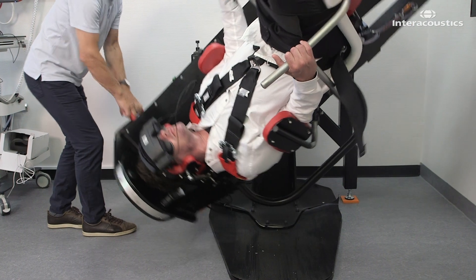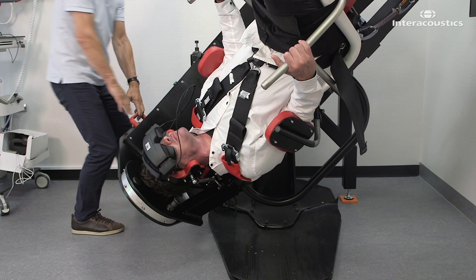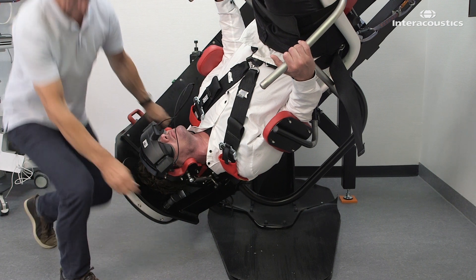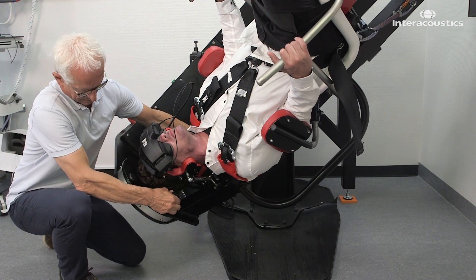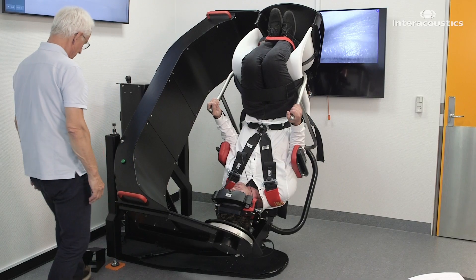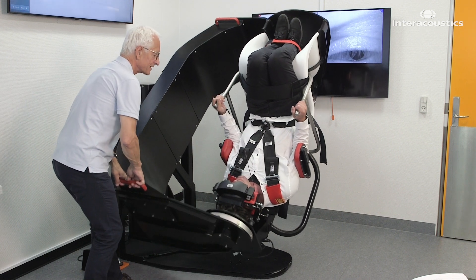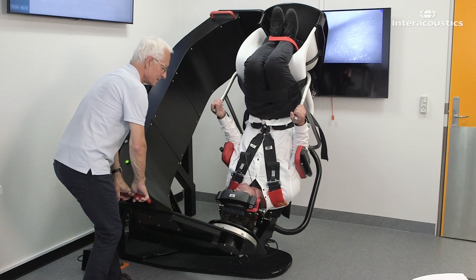To bring the patient into the second position, lock the main arm using the foot switch. Release the plunger and rotate the secondary arm 45 degrees over the healthy ear. Lock it in position. Unlock the main arm with the foot switch and proceed to apply 12 rapid decelerations in this position.